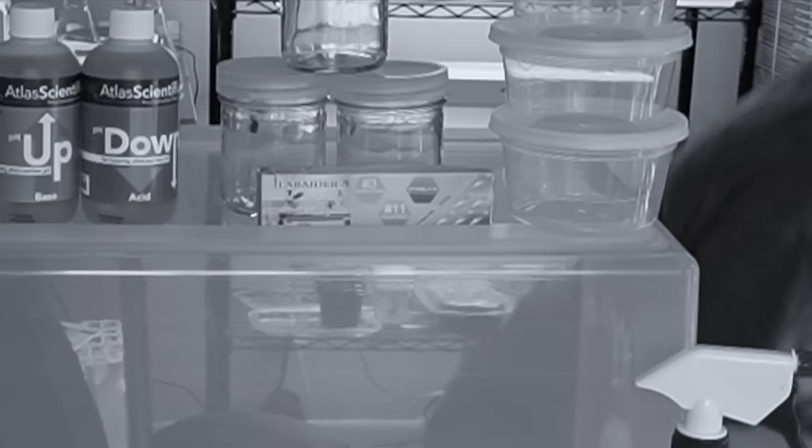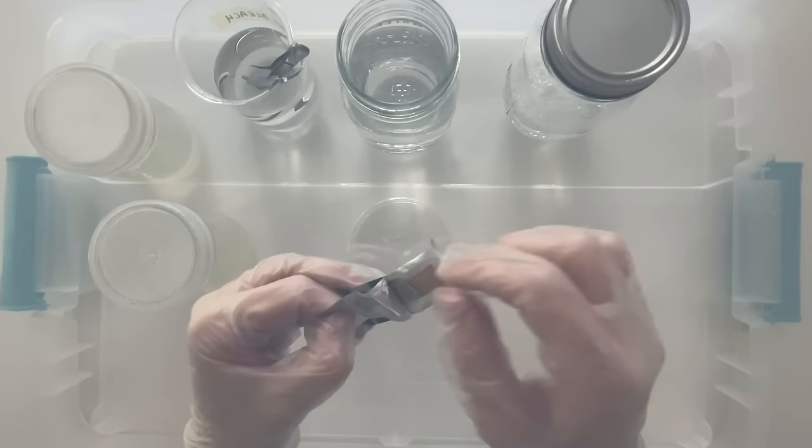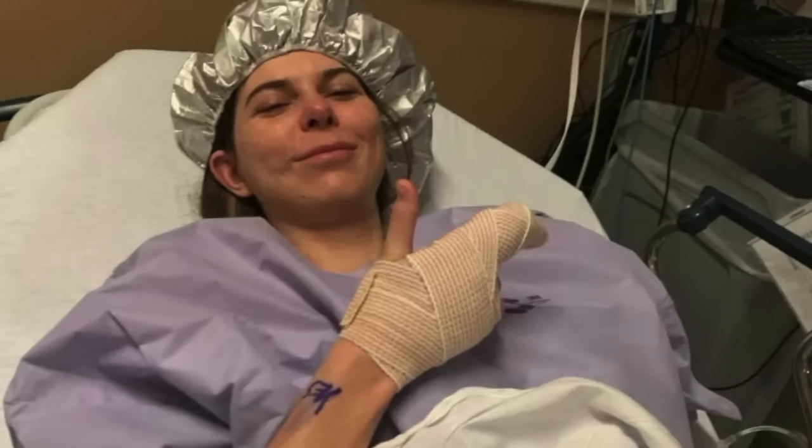This is probably the right part of the video to tell you that I actually injured myself while filming. While trying to attach a blade to a surgical scalpel, I couldn't get it attached with forceps — which is what you're supposed to use — so I picked it up with my bare hands and tried to force the blade onto the handle, which sounds extremely stupid in retrospect. I ended up slicing the tendon of my right index finger, so I decided I will never use a scalpel for tissue culture again. You can use a pair of stainless steel scissors instead.